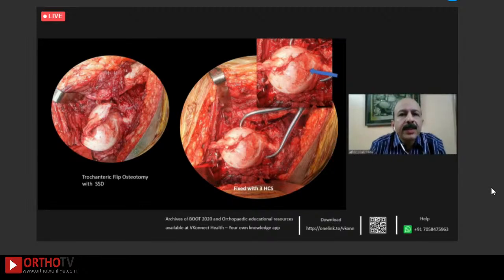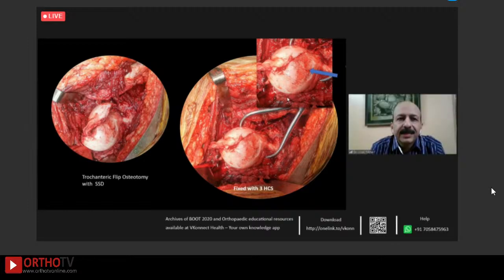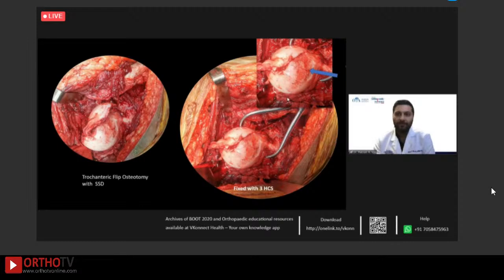Hassan, your experience in this? Yeah, I'm similar to Paul as far as fixing femoral heads with surgical dislocation. I've done a handful. I fixed most of my femoral heads from an anterior approach. You can still see that the cartilage is sloughed from the front, but as far as what to do with it, I've drilled them just because it makes me feel better. I don't know that it actually does anything for the patient. And certainly my discussion with the patient is, your cartilage was torn up, so you're likely to get arthritis in your hip in the future.